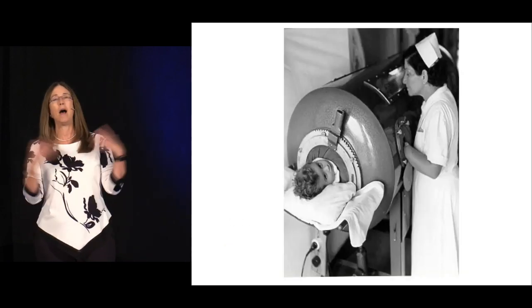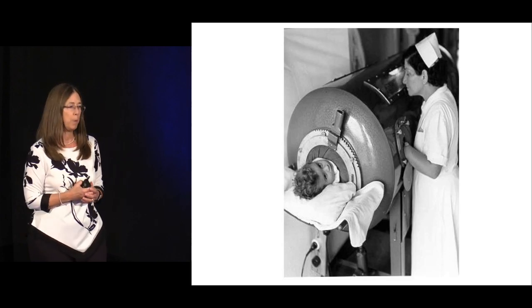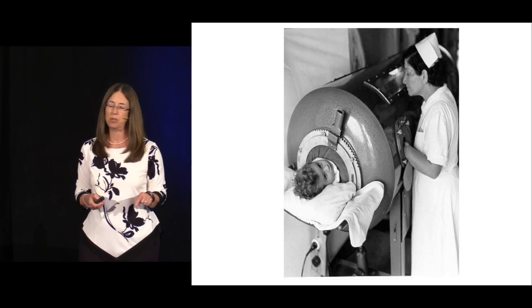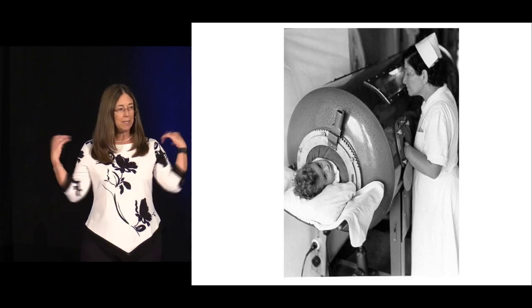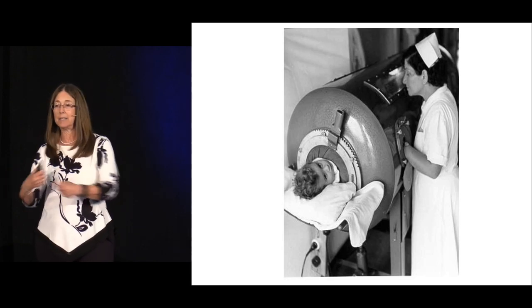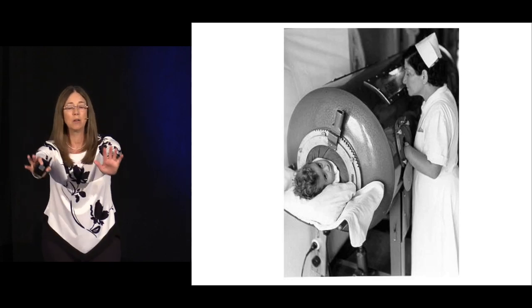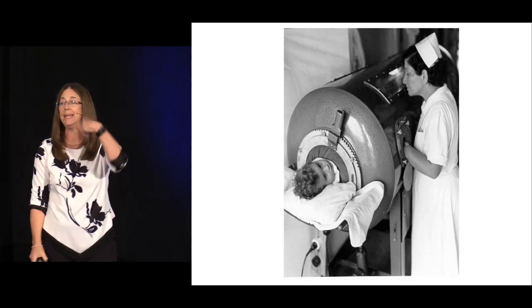Now, it came from the idea, this is an iron lung. Okay, this is in the era of polio. And what's happening to that person inside this iron lung isn't positive pressure ventilation. It's negative pressure ventilation. The person is encased in this big cylinder, where basically air gets sucked out of the iron lung, and when it gets sucked out, the patient breathes in. Then air gets pushed into the iron lung, and they breathe out by all the pressure going out. There's nothing happening in the airway itself.